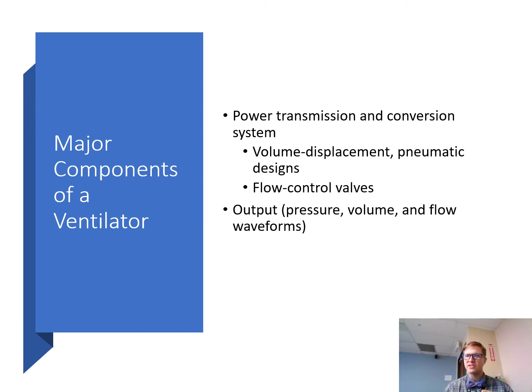These compressors can be driven by a piston, like what we talked about before, or they can have rotating vanes or moving diaphragms or even bellows for those classic old school pictures, right? You'll see those old ventilators that have the bellows. Hospitals used large piston-type water-cooled compressors to supply wall gas to the outlet.